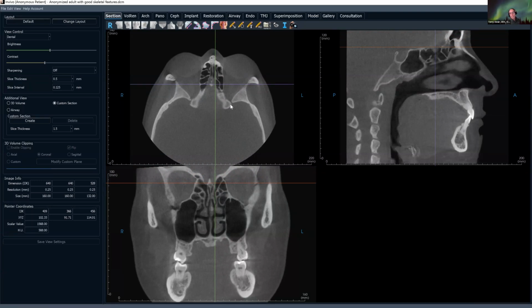This is an important anatomic landmark because very important nerves and cranial nerves and vessels travel through the superior orbital fissure. So again, this is going to just roll out for us anatomically. And right at about the same time, the optic canals open up right here. So we see the superior orbital fissures here, and this is symmetrical. So we have the left side and the right side, and the same with the optic canals. And obviously the optic canals are where the optic nerves live.